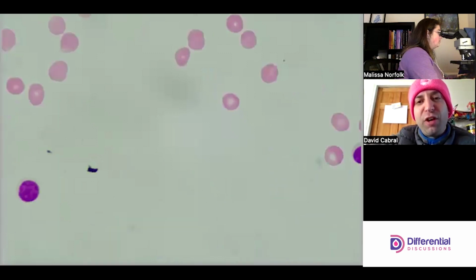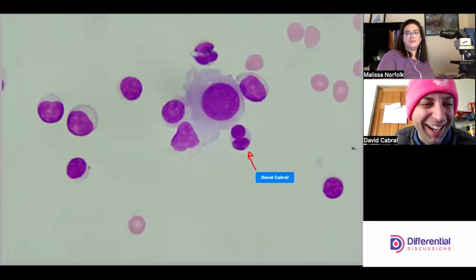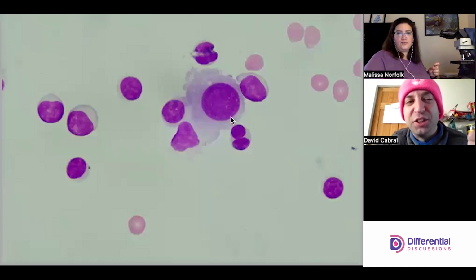Lots of lymphs. Yeah, this is why body fluids is so hard, right? Because the differential seems somewhat unremarkable on its face when you're counting the number of lymphs. Okay, that's a little bit weird. But yeah, it happens, I guess. I think it's just a lymph, a weird one. Yeah, it's definitely a lymph. And then here, definitely shouldn't have two nuclei.